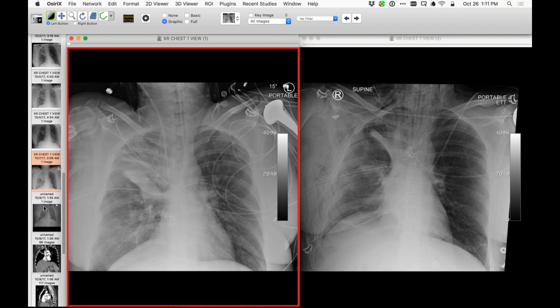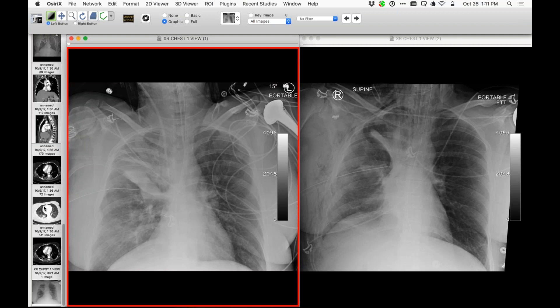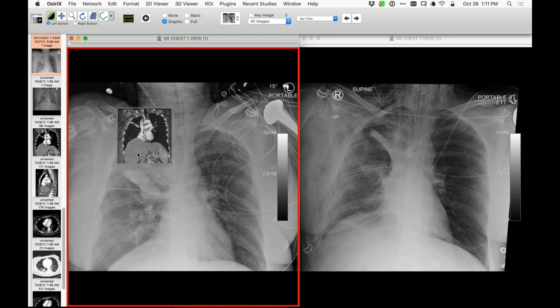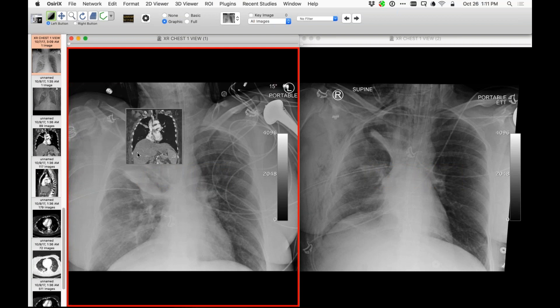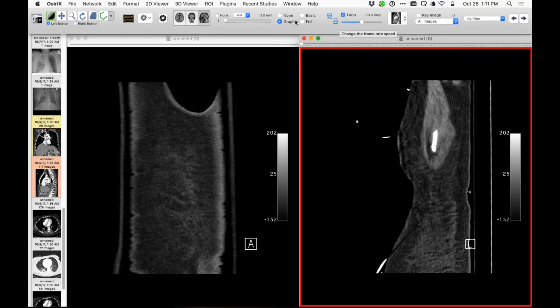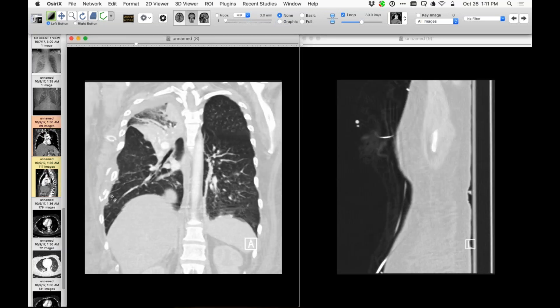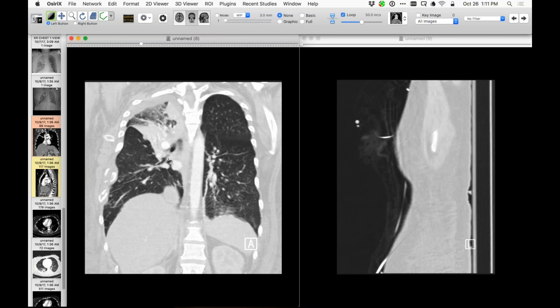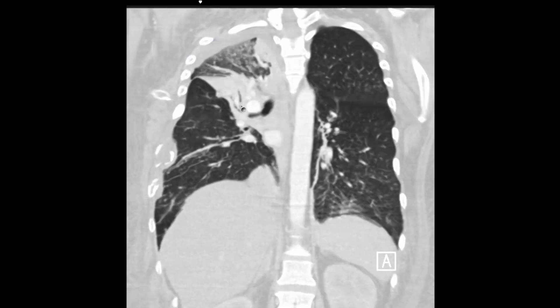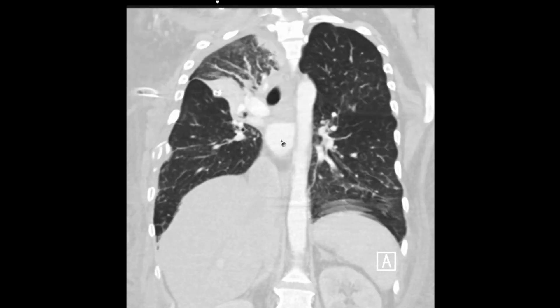This is the seventh — this radiograph on the left. Let me bring in a coronal image from the ninth and a sagittal image from that time as well. On the frontal projection you can see here is that atelectatic lung, and here is a chest tube that's probably at least in part in the fissure. If we follow the bronchial tree, there's some atelectasis in the upper lobe up here. Here is the middle lobe bronchus, and here is some air in medial lateral segmental airways, but otherwise that's the atelectatic right middle lobe. The aerated or hyperexpanded right lower lobe is down here.